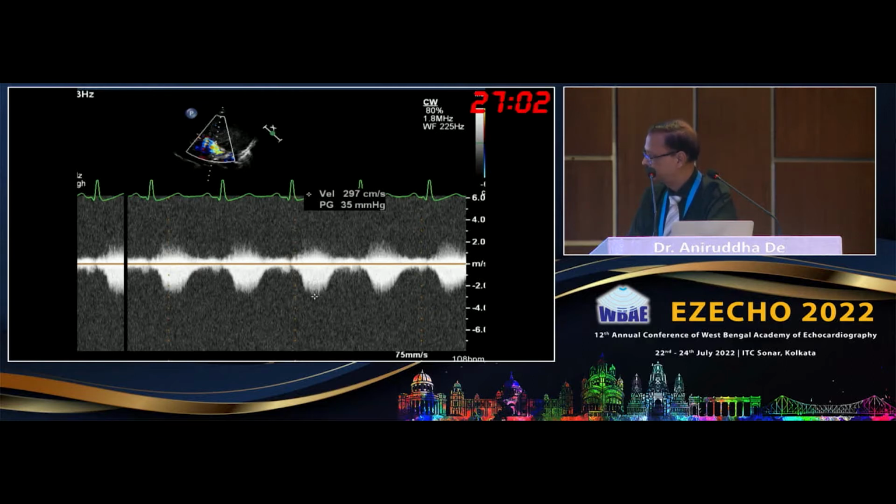No, so the way I look at this mass, as you rightly said, it is a mass in the anterior mediastinum. It is in front of the aorta, in front of the right ventricular outflow tract, and is compressing the right ventricular outflow tract. The mass is extrapericardial, and it's large and variegated, and of course there are multiple spotty echolucent areas. Now beyond that, we did not put any color, we didn't put contrast.